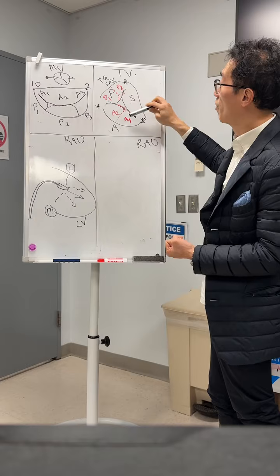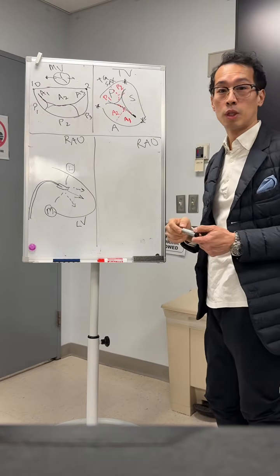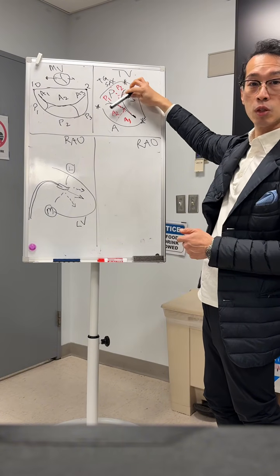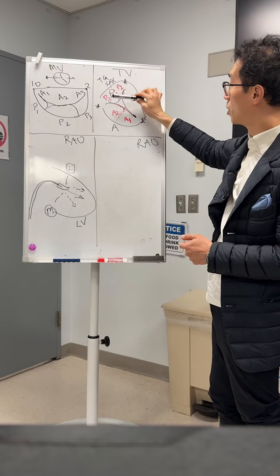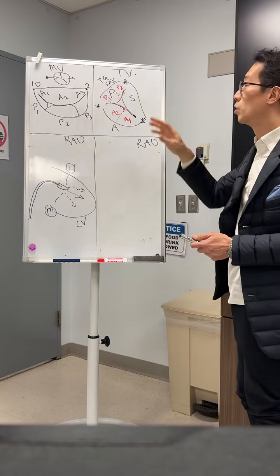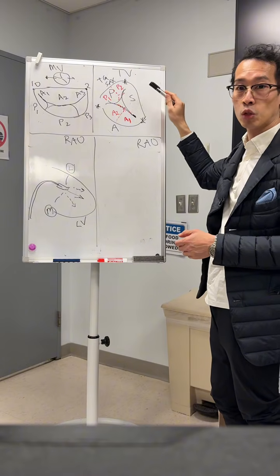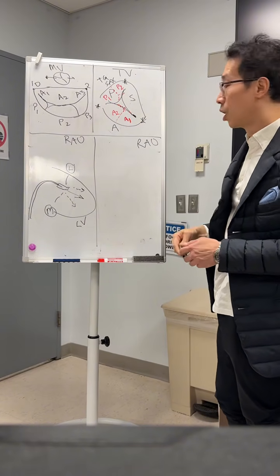But if you think about, let's say, a quadricuspid valve, so we have an A1, A2. You would go maybe for A2S, because that's where the jet is. If P1 is more prominent, then you go P2S. So you need to communicate with your imager where you're exactly grasping on this transgastric short axis view. Again, you can see it's very much equivalent to the mitral view.